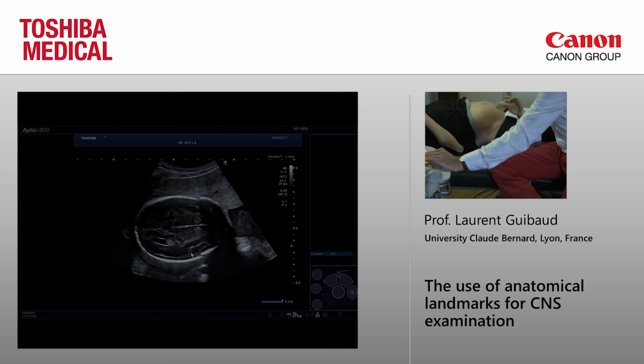So here, you think it's 45 degrees, or orthogonal, or between the two? I think for me it's between the two, and the patient is at 23. So for us, it's good to know that she's at 23 for sure.